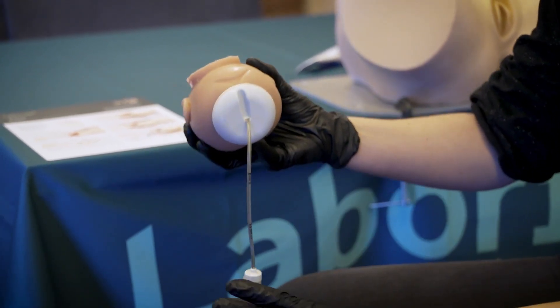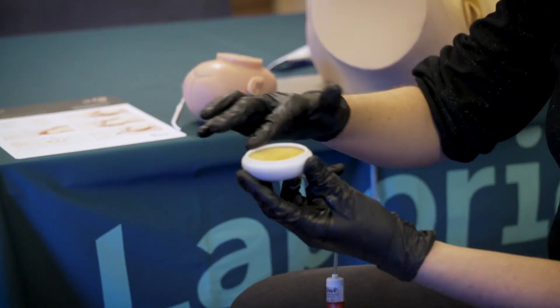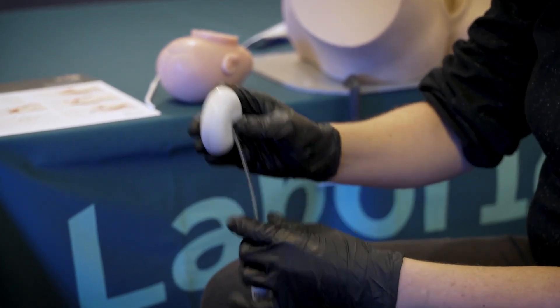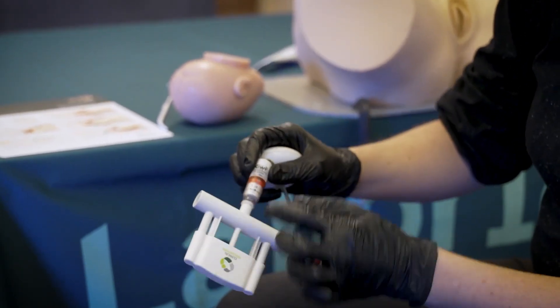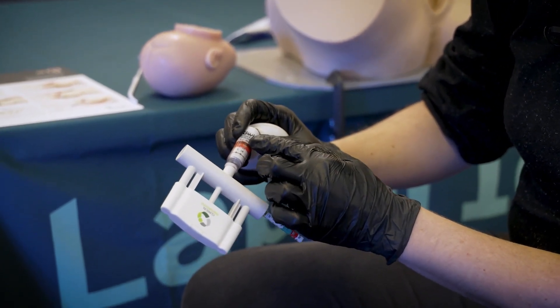When you apply the cup, make sure you don't put lots of lubricant under the cup — you want that as dry as possible. When you're pulling, make sure your traction force is no greater than 11 kilograms of force.